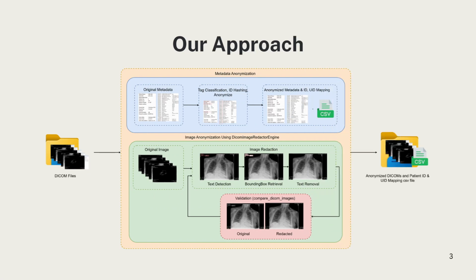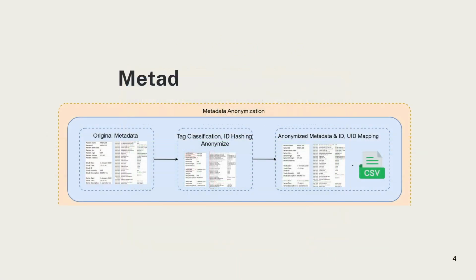Our model workflow begins with the intake of DICOM files as input. We then anonymize the metadata and visual data within each DICOM file separately. After completing these two anonymization processes, we merge the anonymized metadata and visual data into a single DICOM file.